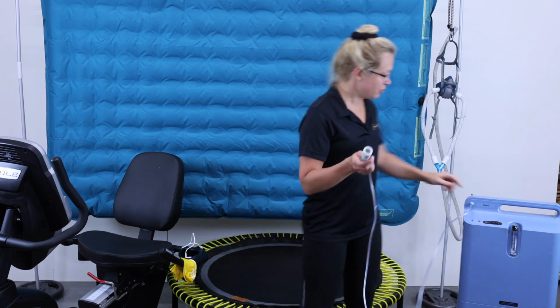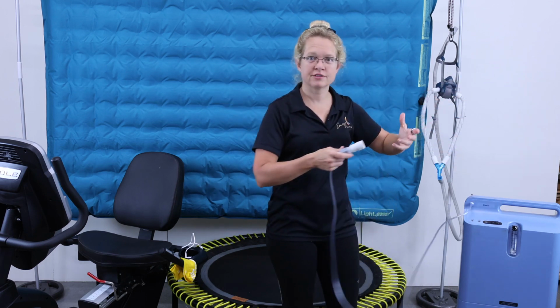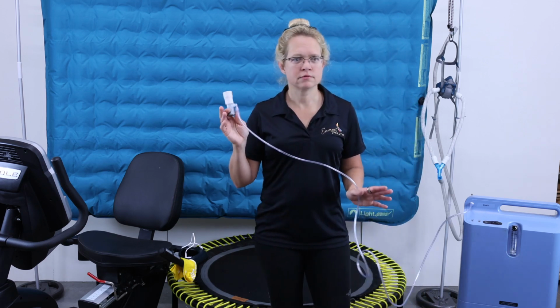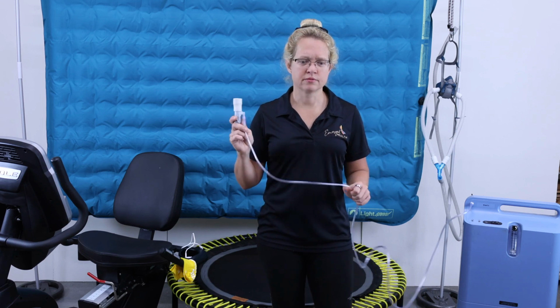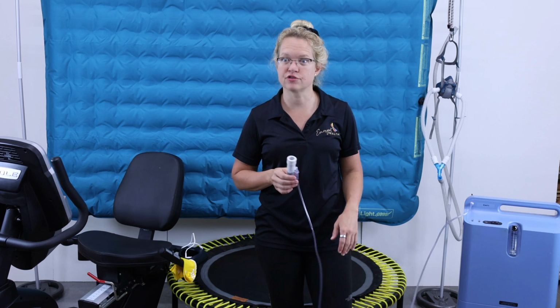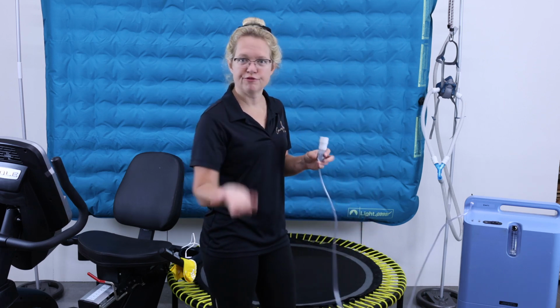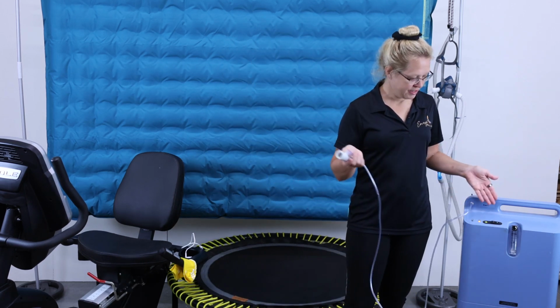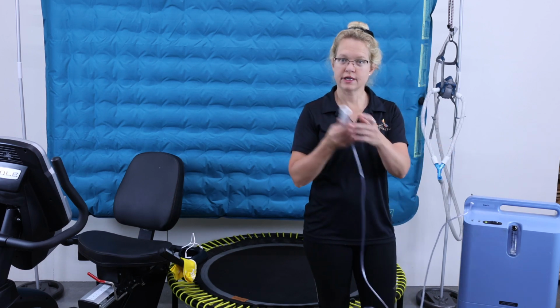And then what you do is you turn the oxygen concentrator on, and it will take air from the environment, and it will exit this at between 94 and 97%. Usually most oxygen concentrators do 96% oxygen, and they create it from the air around you. They just concentrate the oxygen around you, so you don't need to buy oxygen tanks and have them filled or anything like that. So you turn on your oxygen concentrator. It makes a beeping noise at first, and then you hear a motor, a pump, and now it's creating oxygen.